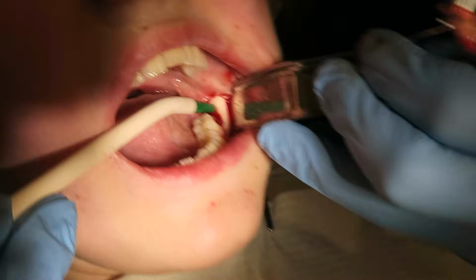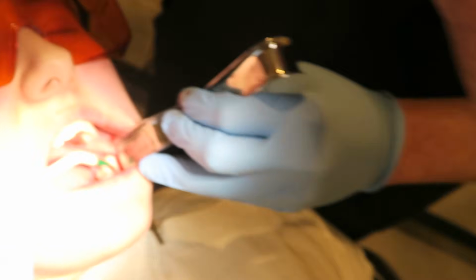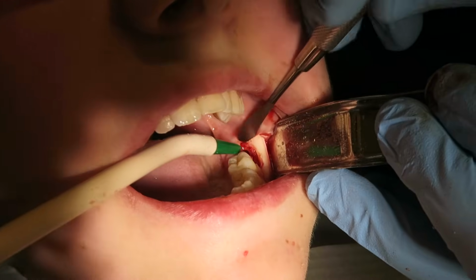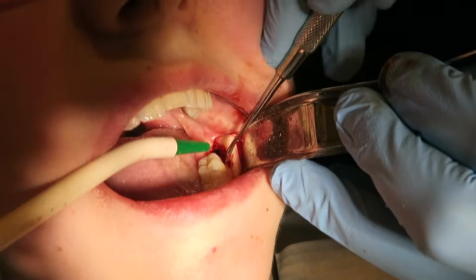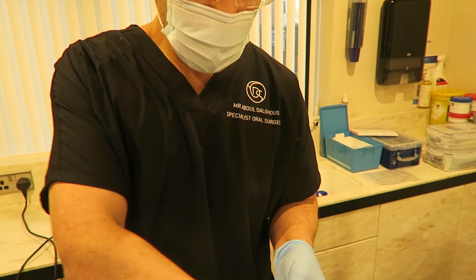Making sure I've removed all the fragments. Now tidying up and making sure nothing has been left behind. Once you're happy, then you close the wound.